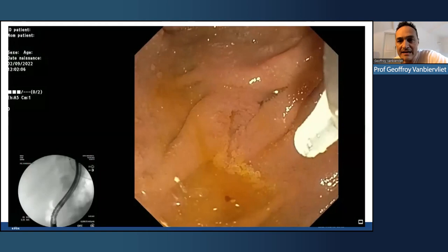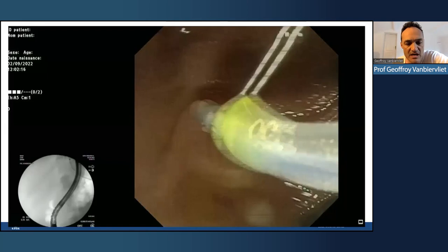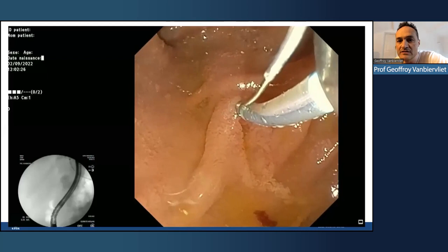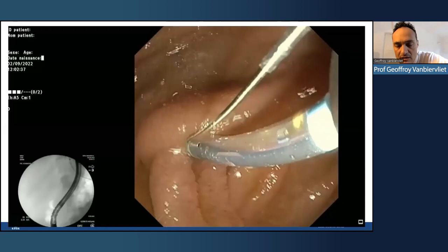It was a patient with a stone, and I want to leave you the video without any break or cut, because it's just to understand that sometimes real life is for everyone. So here I use the AXe tome from MedWork to perform this procedure, which is very nice due to the very thin tip of the sphincterotome. And I start like I usually start.